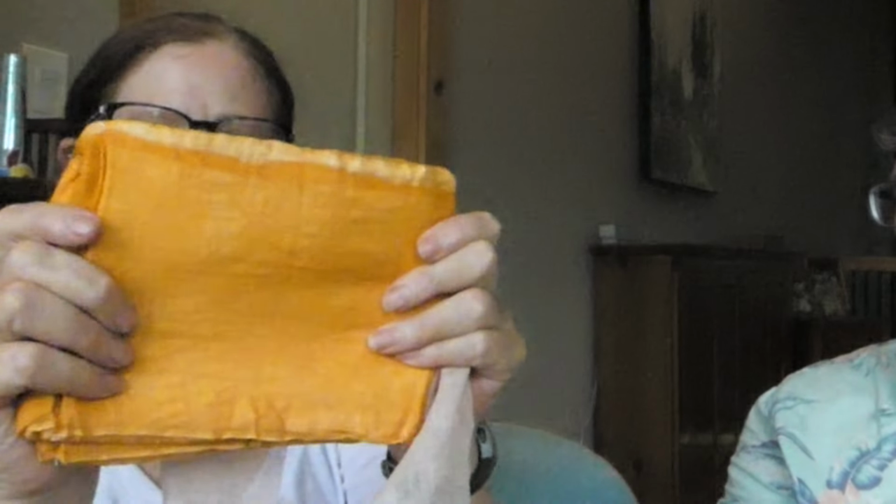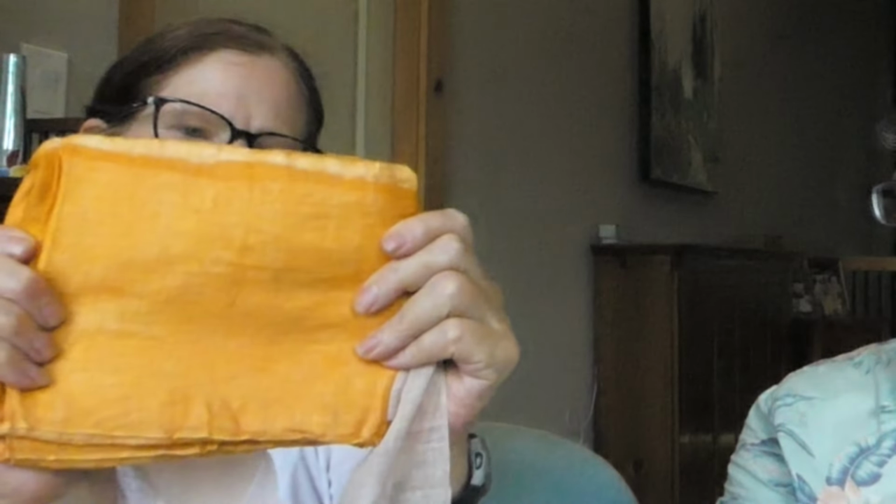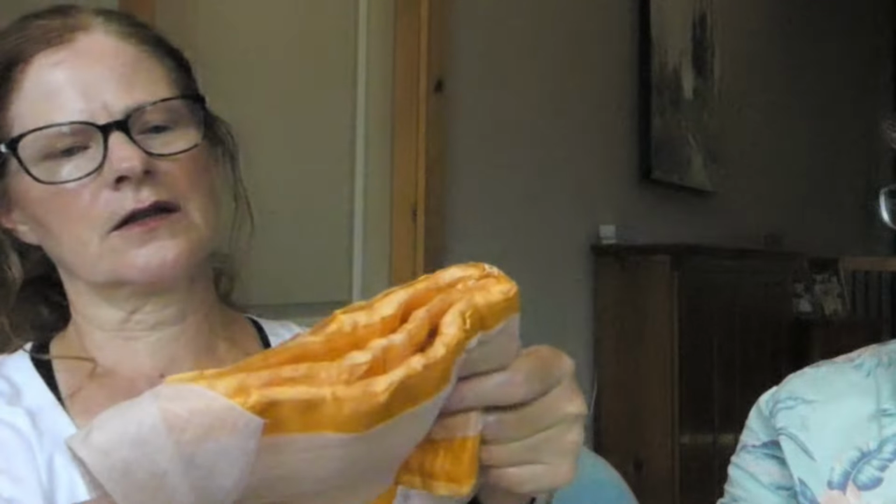It's like triple layered, like a sandwich here. So you could use it full thickness, depending on the size of the wound, or there's little ties that you could cut and presumably it would open out, so it could be a wrap around a thigh or it could be wrap around a bigger wound. And we don't know whether this was the original color or if it's discolored since 1961.